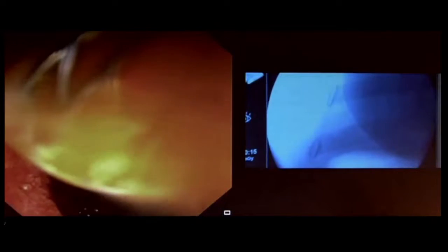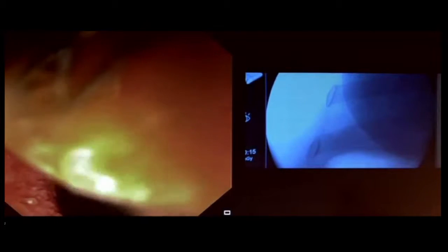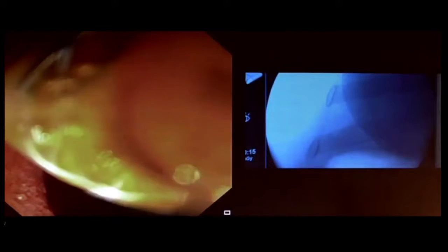You unlock the... So just a quick moment so we can get the fluoro in position, and then we'll just watch the removal of the stent with fluoroscopy. We should see it pull out very nicely rather than trying to pull it into the working channel. But as I said, usually you can pull the stent right into the working channel. Just pull it right out. That way you don't have to re-intubate the patient again.